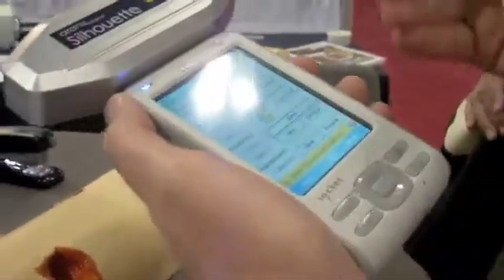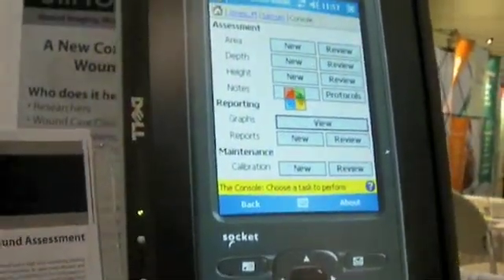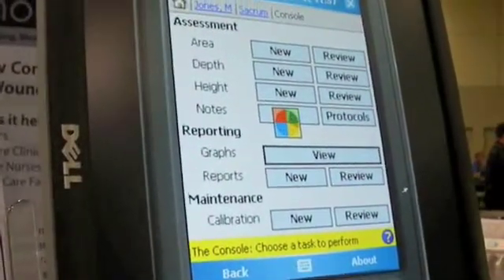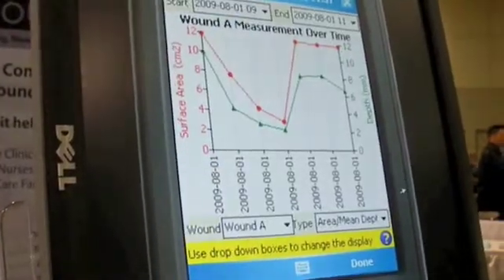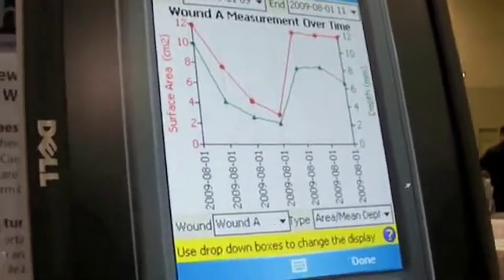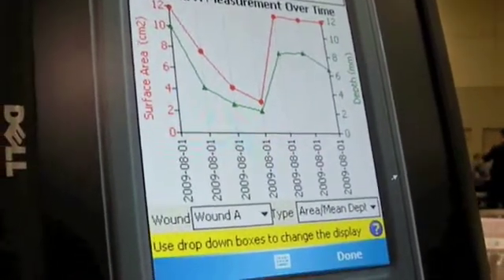Because all previous assessments are stored on the device, if we want to review what the wound looked like in the past, we can bring them up on the display. We also have all the measurements as well, so we can bring up a graph to see what the healing trajectory is looking like. As you can see here on this wound, it was healing initially and has been reasonably constant over the last three assessments.